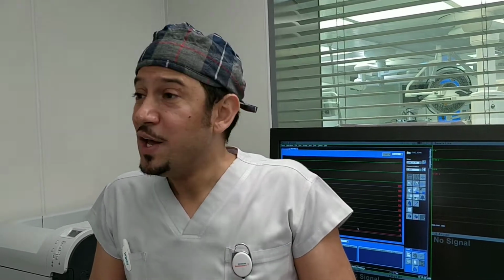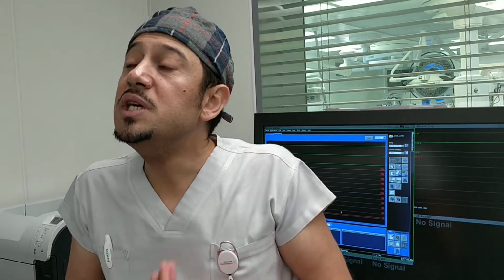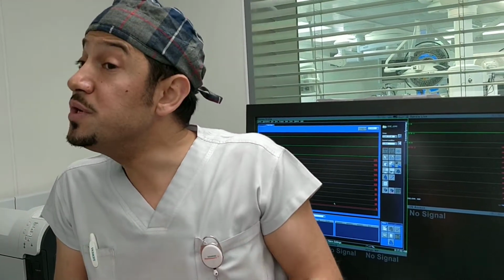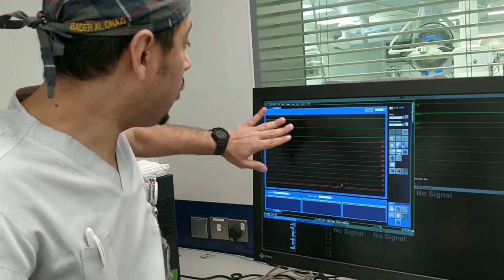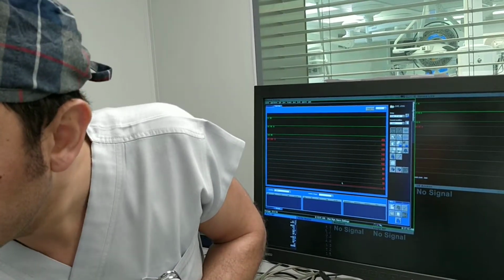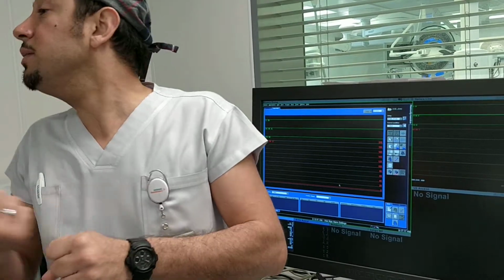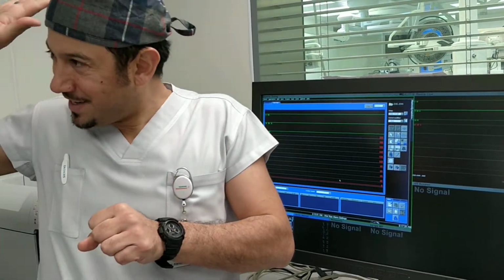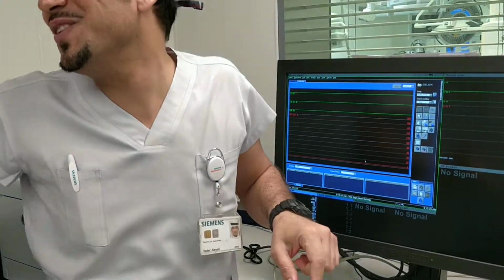So always presume, where is your ECG? When you see ECG changes, you know something is going on, but you cannot be 100% sure until you know where is your lead, okay? Make sense? Good. So this is only to show you ECG, depending on where you attach them. Very good, okay. Attach them to the butt, I'm going to go to the emergency butt. Just kidding, I like to kid you.